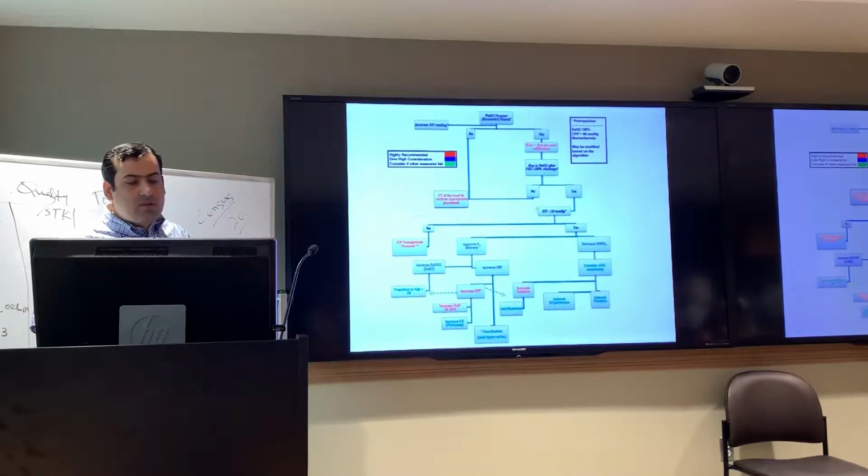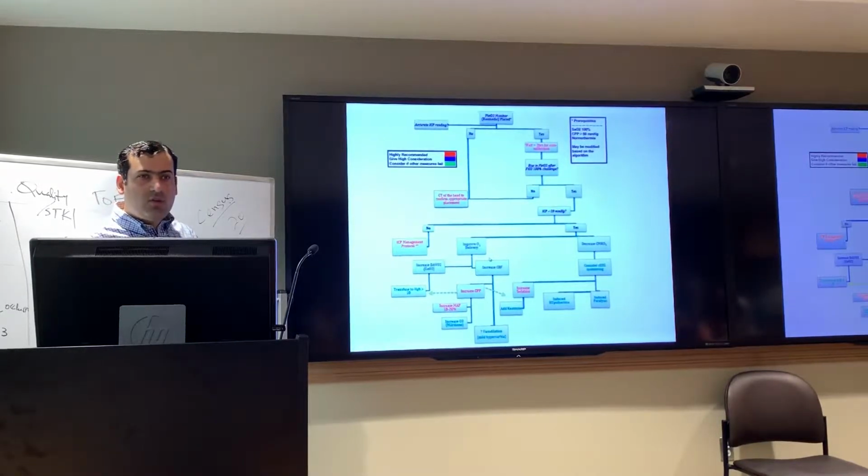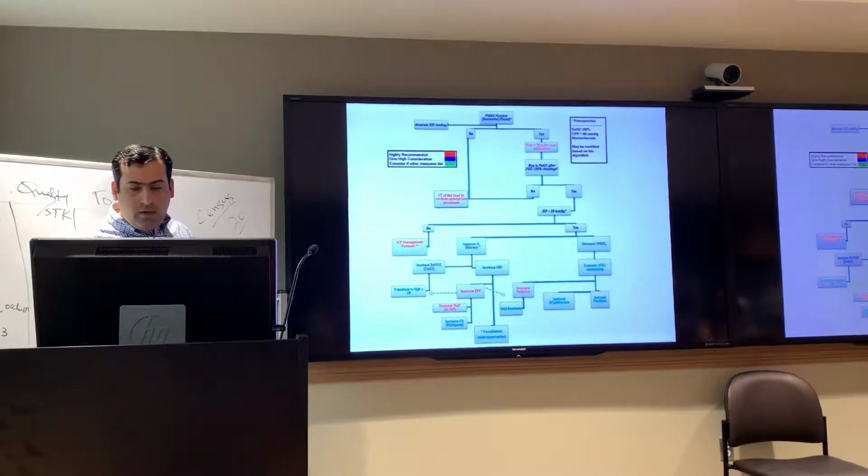But if your ICP is normal and your PbO2 is low, you have two strategies. One is to bring more oxygen to the brain, to increase delivery of the oxygen. Or decrease the consumption. How can you change that?